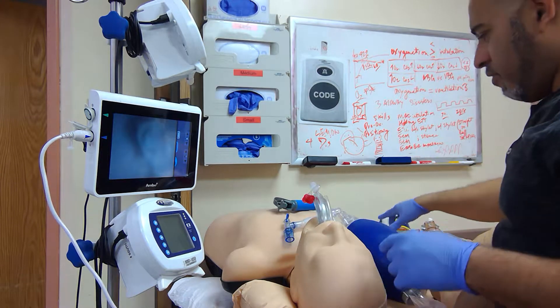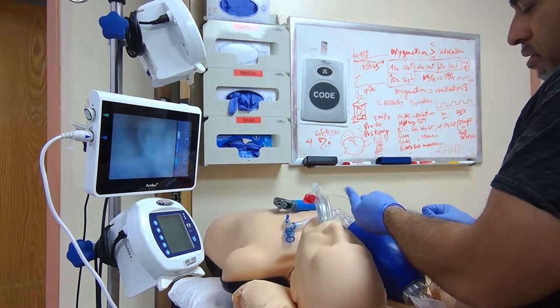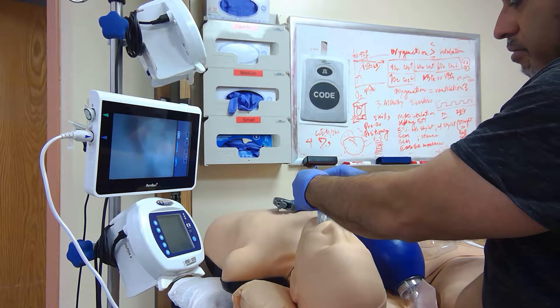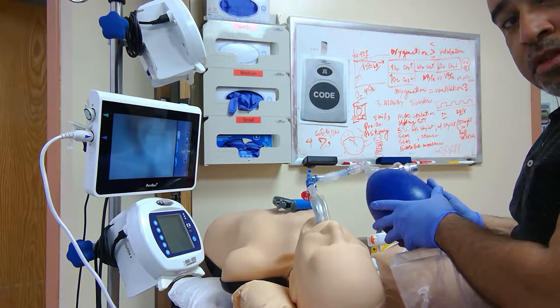For those non-believers, the device is in. Inflate the cuff, connect your end-tidal CO2, and bag up the patient — all of the above. It's good enough to convince everyone else the tube is in.